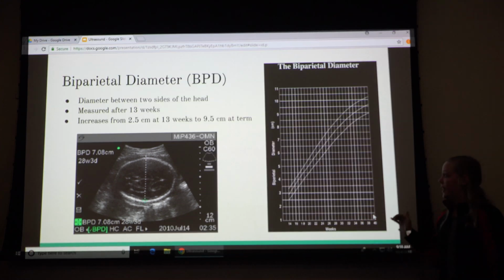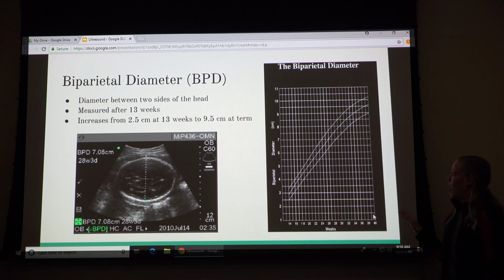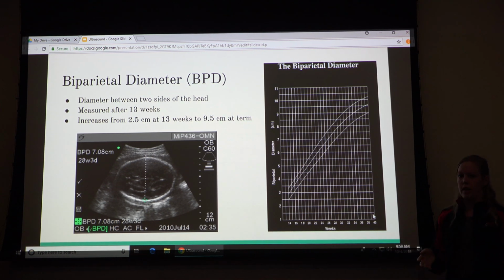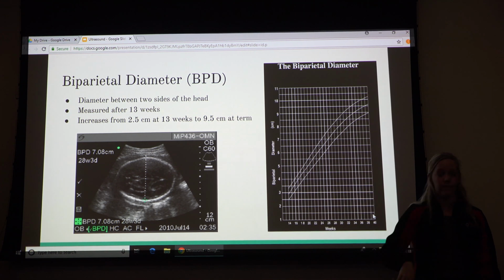We have to keep in mind that these graphs are just for visual representations. All of this information is actually integrated into the ultrasound, so doctors have all this information with the click of a button.